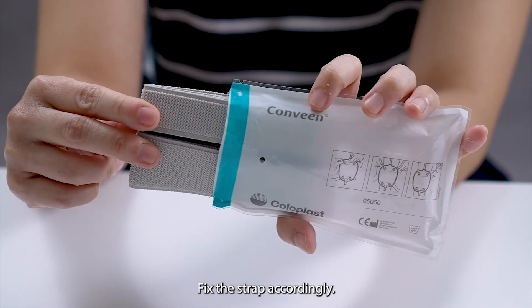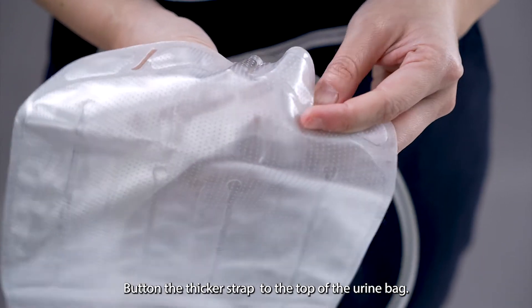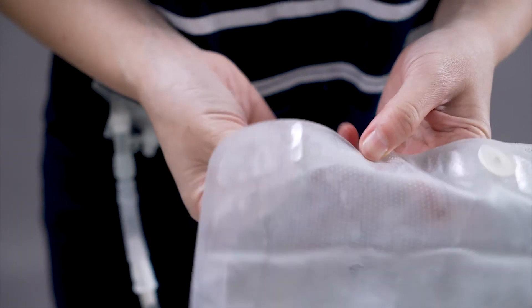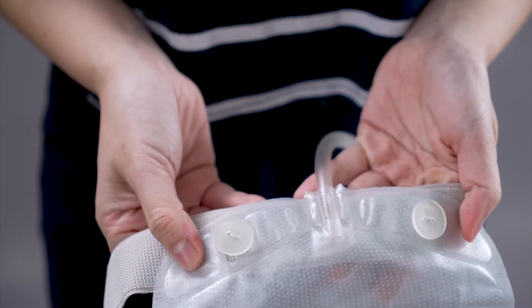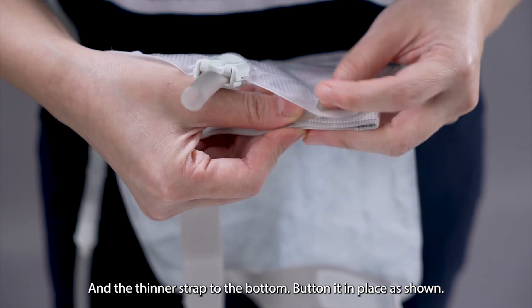Fix the strap accordingly. Button the thicker strap to the top of the urine bag and the thinner strap to the bottom. Button it in place as shown.